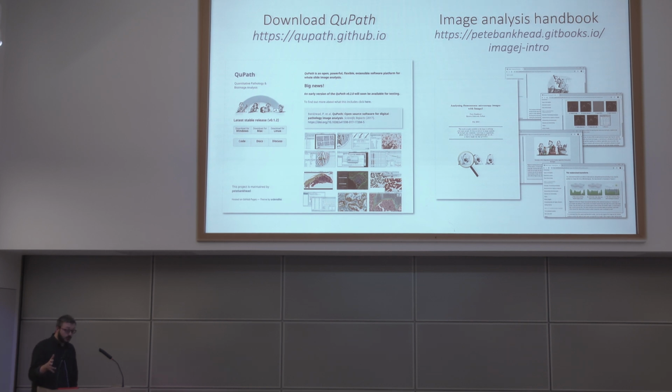So when it comes to QuPath, a lot of the features are there mostly because I needed them. Sometimes they're developed to be nice for somebody else because somebody else needed them, but if I needed them, they've got a higher chance of being in there. But the plan is hopefully to expand the number of developers and to improve this so that it can become a lot more comprehensive in what it does and to make things more user-friendly, to make the deep learning not crash. And so that's what's coming in the future.